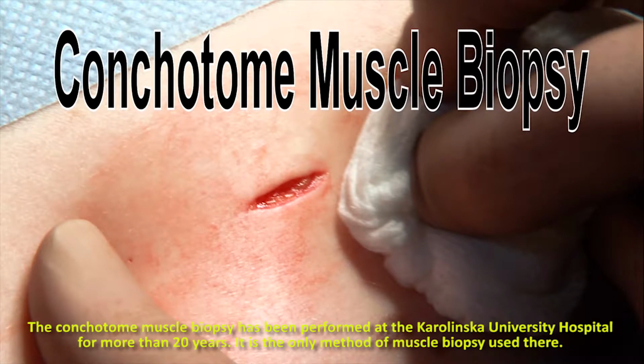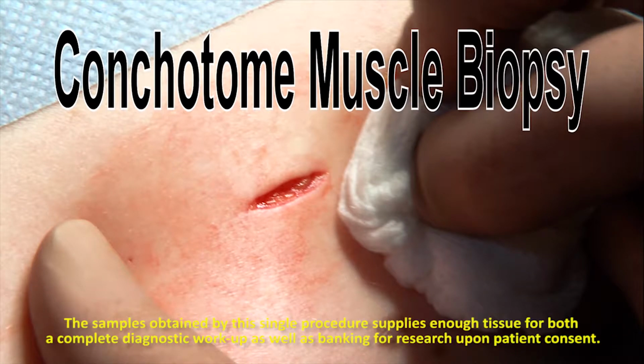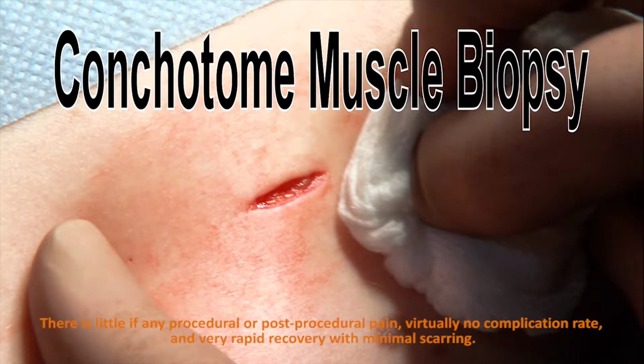The Conchotome muscle biopsy has been performed at Karolinska University Hospital for 20 years. It is the only method of muscle biopsy used there. The samples obtained from a single procedure supply enough tissue for both a complete diagnostic workup as well as banking for research upon patient consent. There is little, if any, procedural or post-procedural pain, virtually no complication rate, and very rapid recovery with minimal scarring.